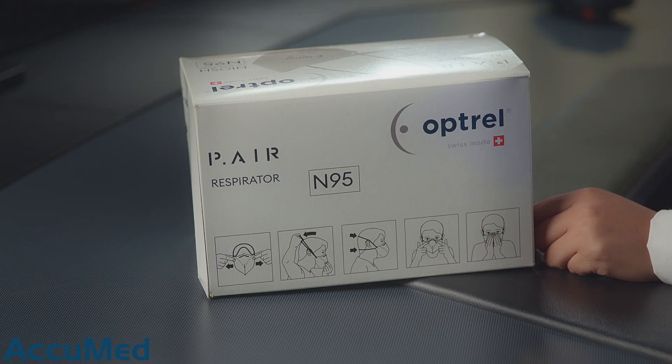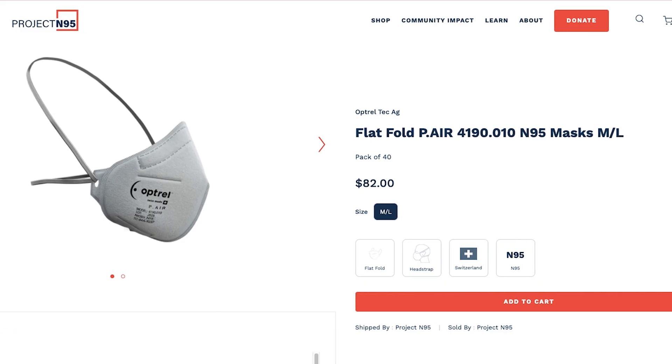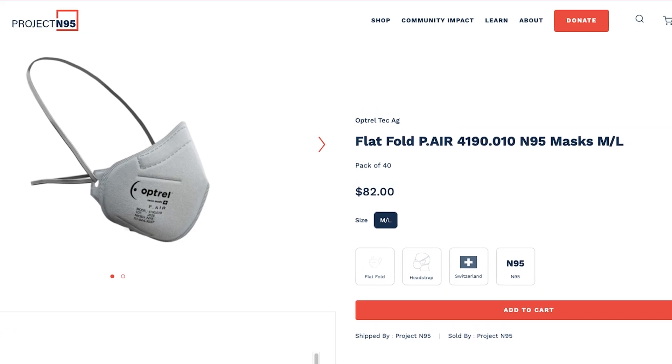Hello everyone and welcome back to the AccuMed channel. Today we're going to be reviewing the Optrel Tec N95 respirator. These are manufactured in Switzerland and we purchased them from Project N95.